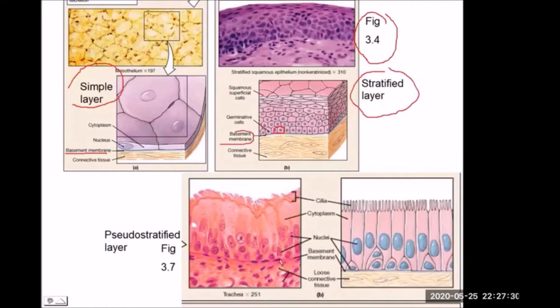And the photograph here showing the pseudostratification, and really what appears to be stratified, what's falsely stratified, is the appearance of the nuclei. So it does appear as if one nucleus is superficial to another, and that is the case for the nuclei.